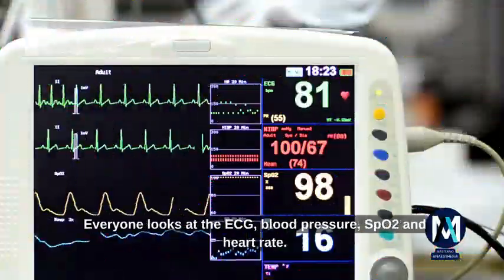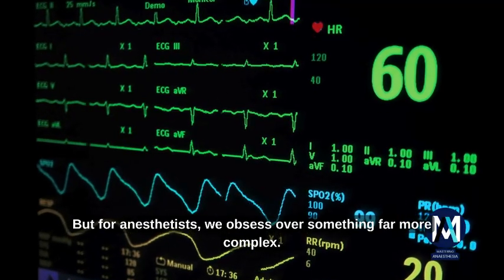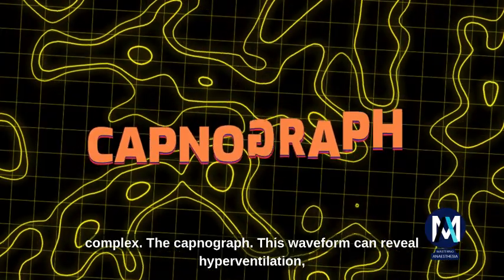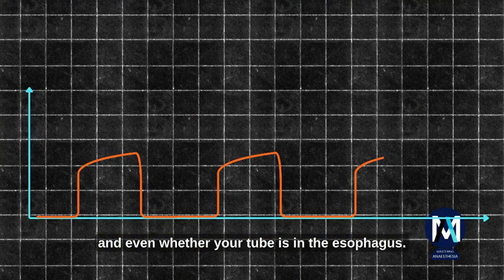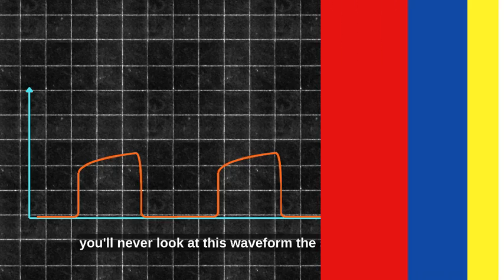Everyone looks at the ECG, blood pressure, SpO2 and heart rate. But for anaesthetists, we obsess over something far more complex. The capnograph. This waveform can reveal hyperventilation, bronchospasm, cardiac arrest, circuit disconnection, and even whether your tube is in the esophagus. And once you understand capnography, you'll never look at this waveform the same way again.